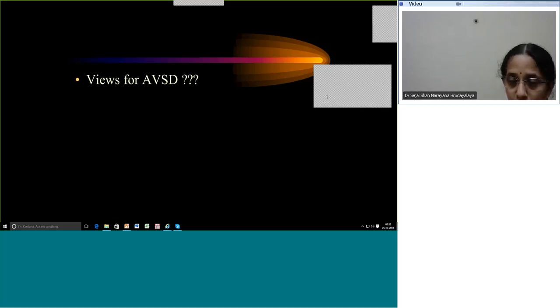Yes, so it's mid-esophageal 0 degrees, 60 and 90 degrees to open up the different components of the mitral valve, 120 degrees is to assess the atrial septum. Okay, I would say 60, 90 and 120 degrees would be probably to assess the mitral valve in different segments, the AV valves and the LVOT.